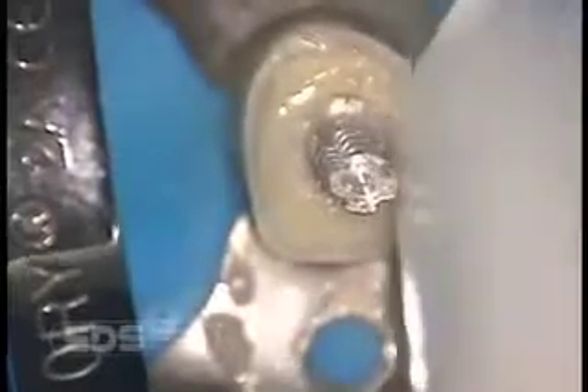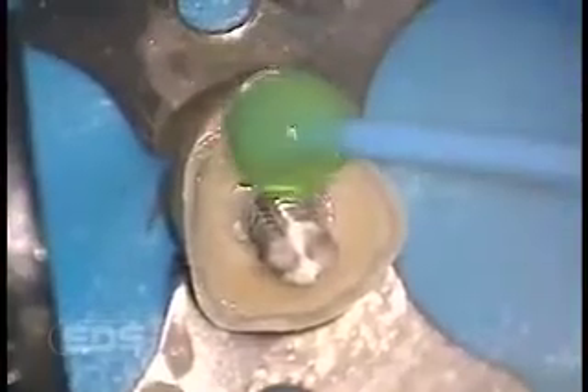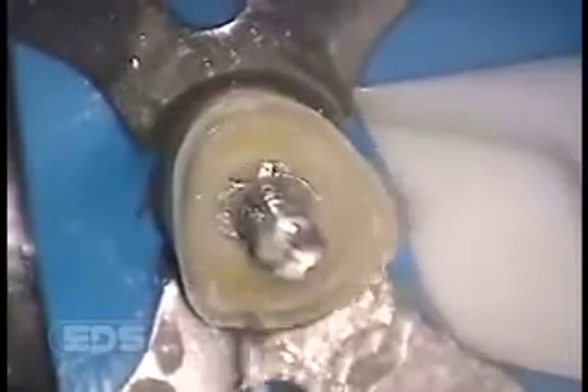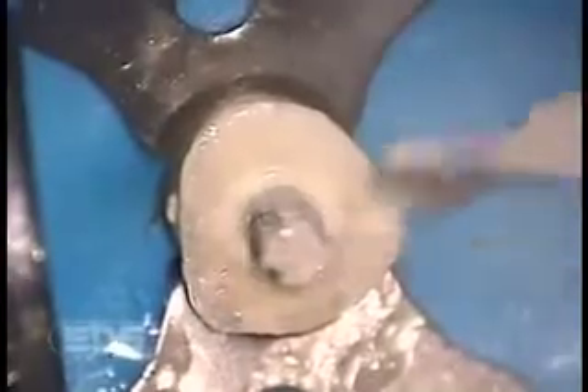Excess cement is now suctioned away. We are now acid etching in preparation for a bonding agent for the core material. We recommend any fourth generation bonding agent. The surface area is etched for 15 to 20 seconds and then washed with water. As you can see, the flange is fully seated. Now we place the pre-mixed bonding agent — in this case a self-cured total etched bonding agent.